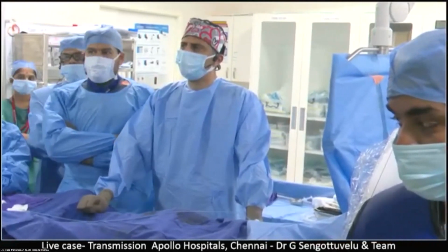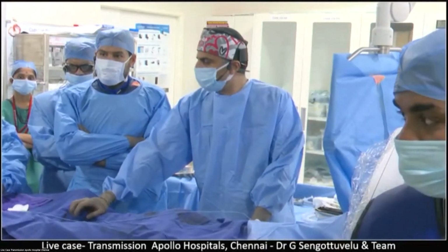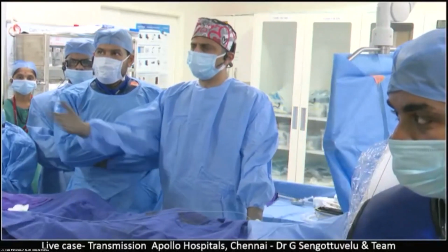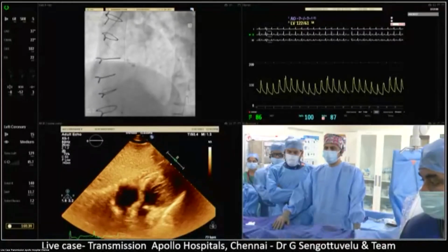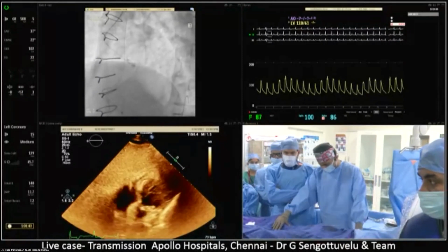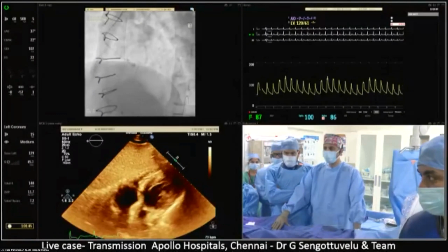In this case, the ECG didn't show any pre-existing conduction system block, and we are not going to use an Evolut valve, so we are not really concerned about the conduction system in this case. But of course, it's a good idea to measure the membranous septum. Saurabh, you do a lot of balloon expandable SAPIEN. Any concern with balloon expandable with this anatomy?